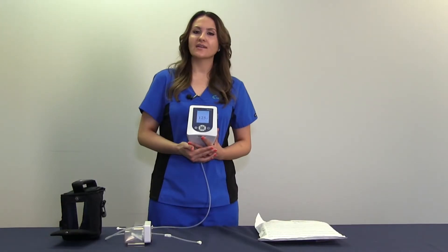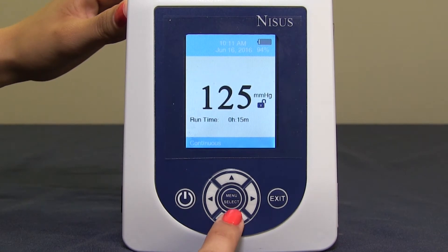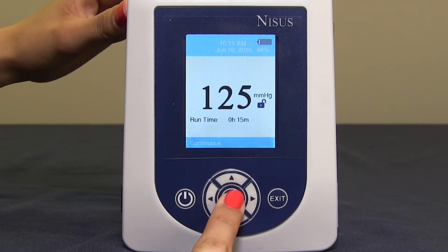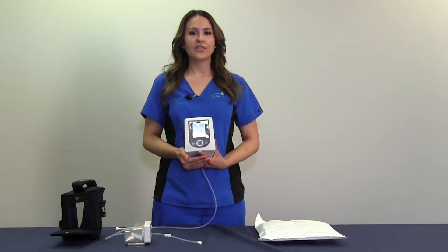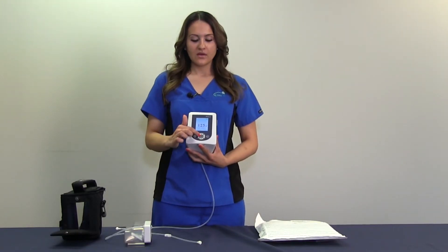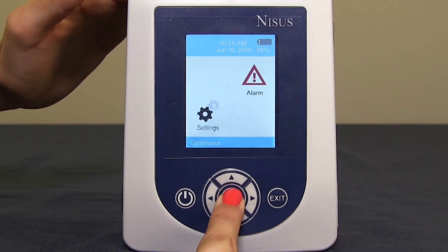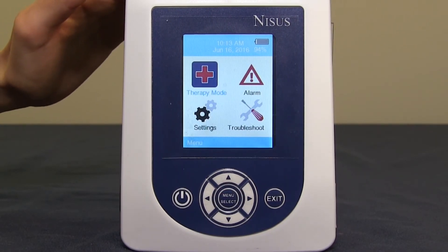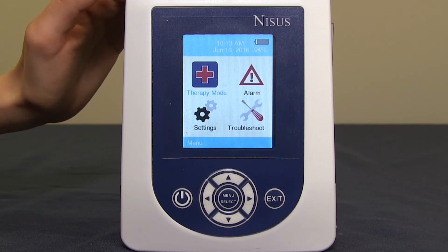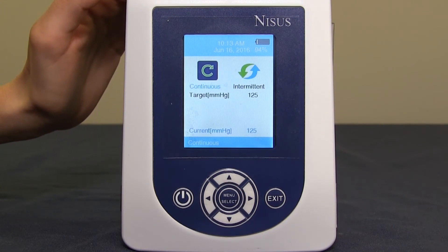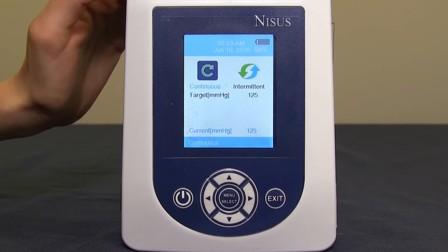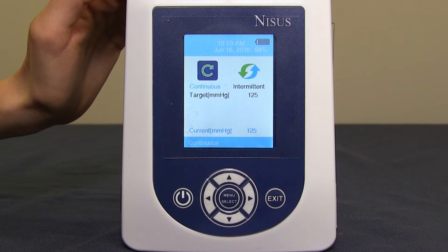In order to access the menu, locate the menu select button. Now you have four different selections to choose from. In order to access therapy mode, find your menu select button, press down, and make sure therapy mode is highlighted. Once highlighted, press menu select, and now you have two different choices: continuous mode and intermittent mode. These therapies will be changed or adjusted by your clinician.